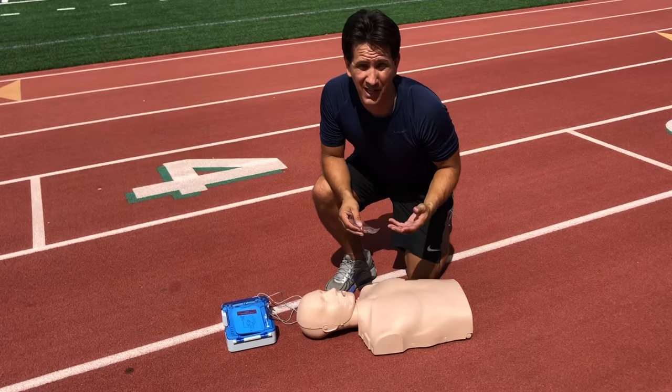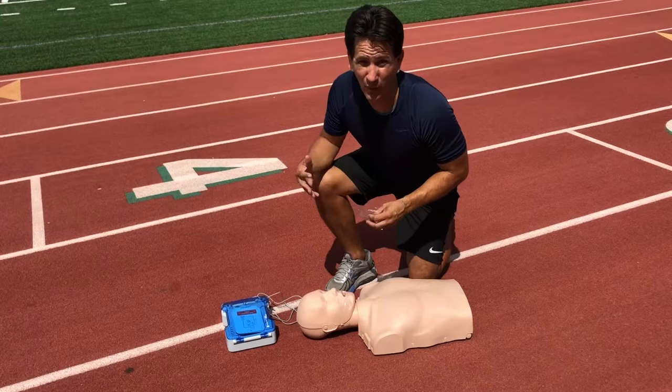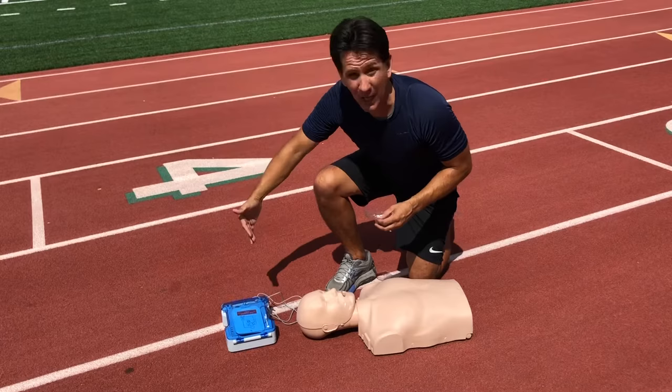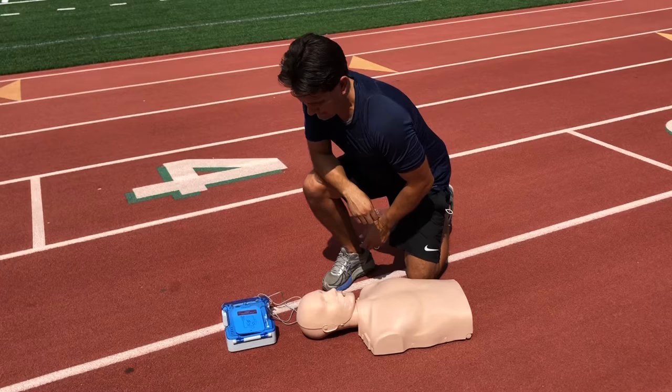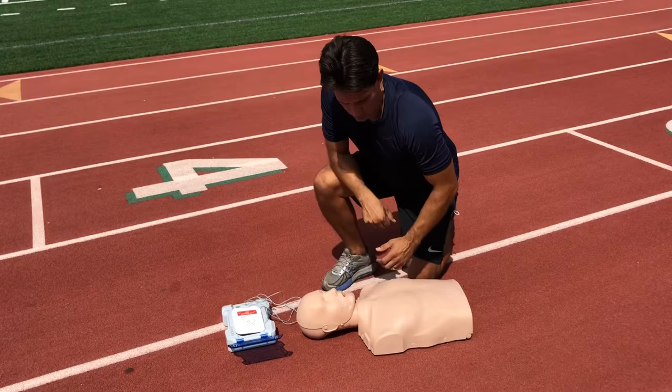If you do have an AED, you request one to be summoned — ask someone to get it. When it arrives, they set it down by the head. First thing you're going to do is turn it on. For an adult patient, leave the default setting; if the patient is a child, press the child button. Then remove clothing from the patient's chest.